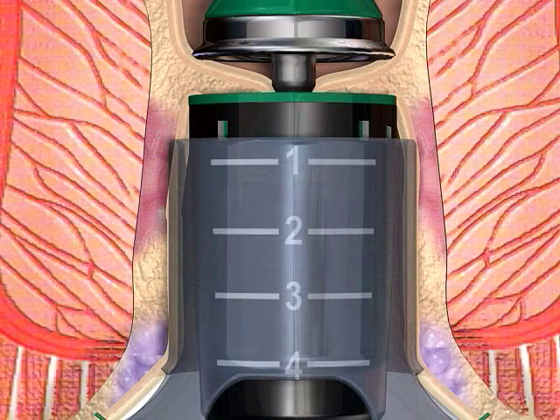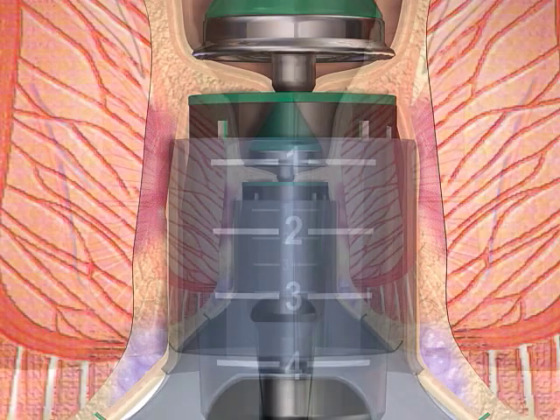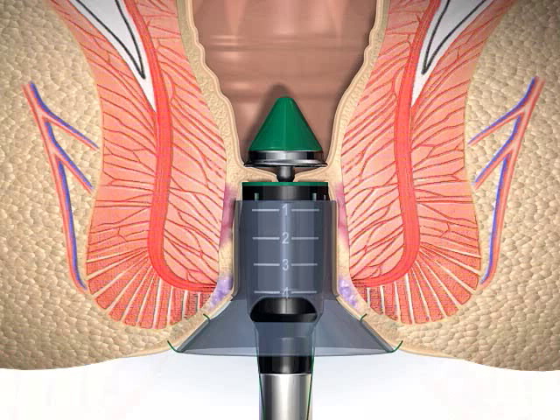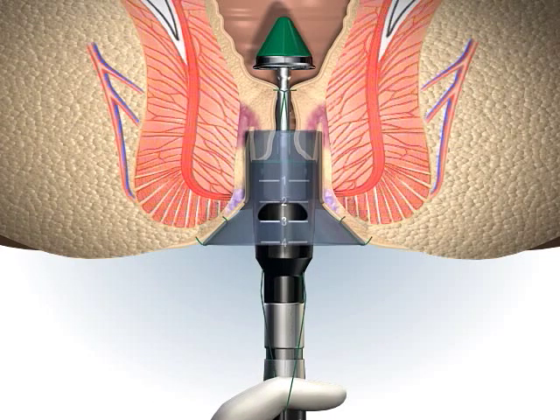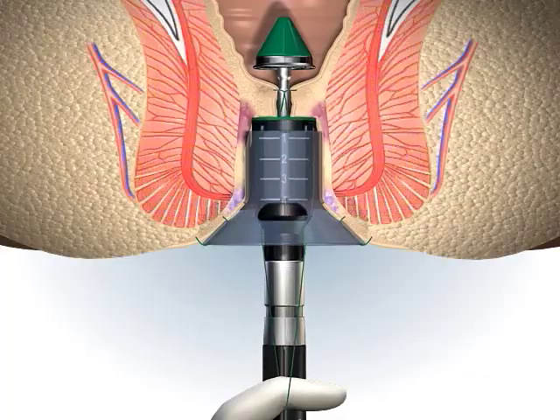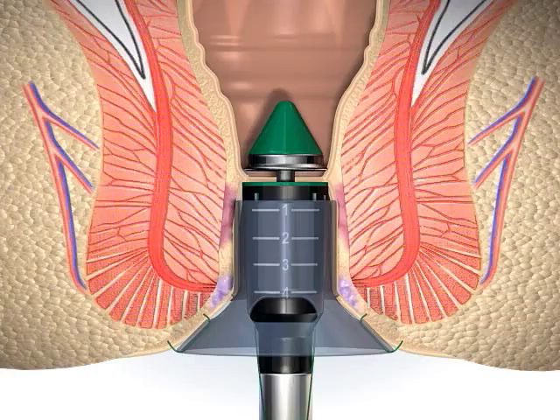The stapler is examined to ensure that it is aligned along the axis of the anal canal. Prior to firing, the stapler is then partially closed, advancing the staple housing into the anal canal.